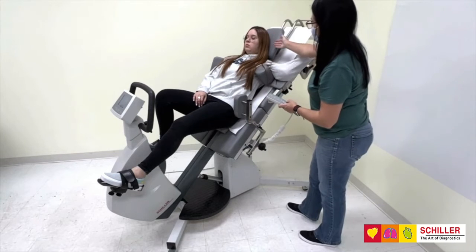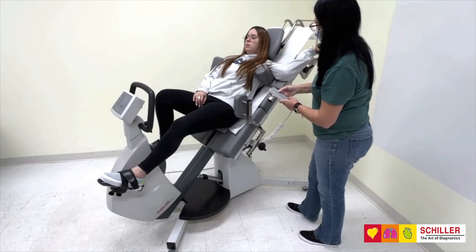The height of the head rest is adjusted with the remote control and can be further adjusted manually.